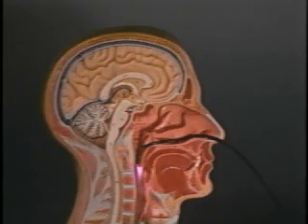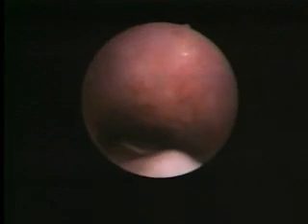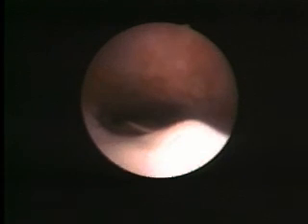Now deflect the tip downward for your first look at the larynx. Ask the patient to breathe through his or her nose to relax the soft palate, providing additional room for the instrument. As the scope slides over the posterior portion of the soft palate, laterally just beyond the uvula, you'll find the palatine tonsils. Here at the level of the uvula, you can observe the posterior third of the tongue and lingual tonsils.